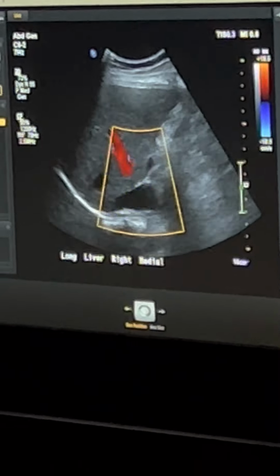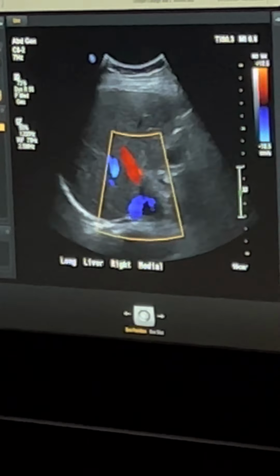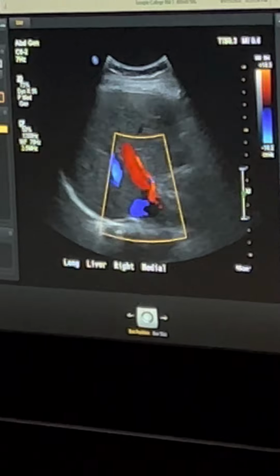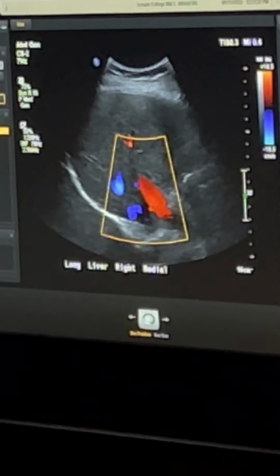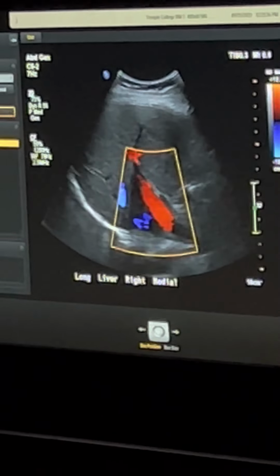You guys probably haven't had that with Lisa yet, huh? Look at that hepatic artery. I know, right? Your abdominal Doppler would be so good. Look, I even have your CBD. She's such a good scan.